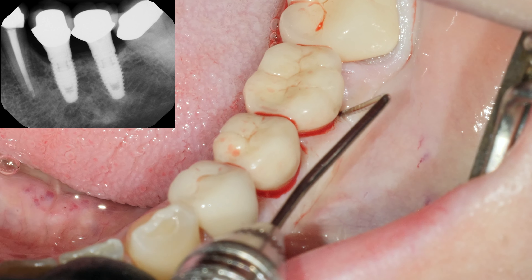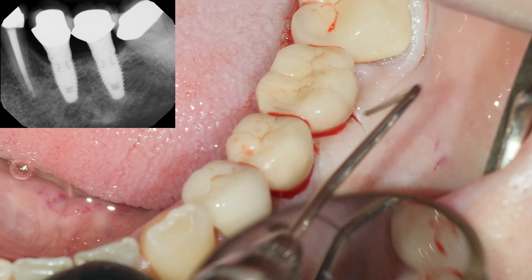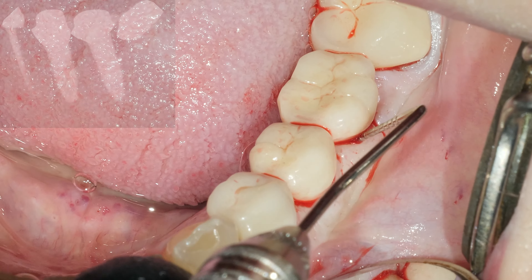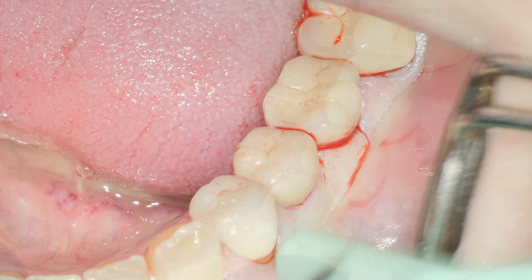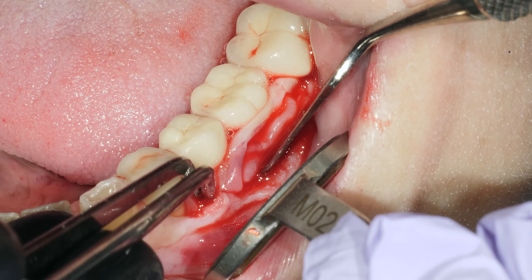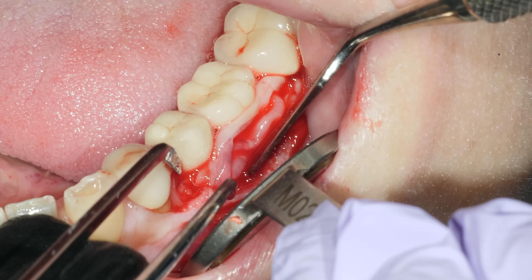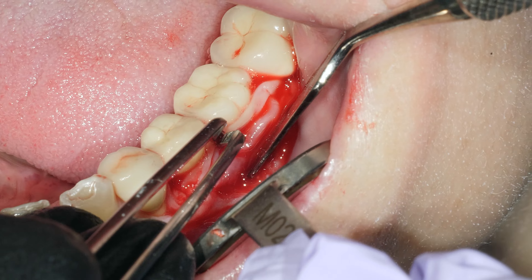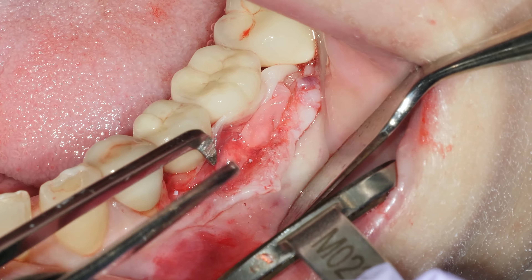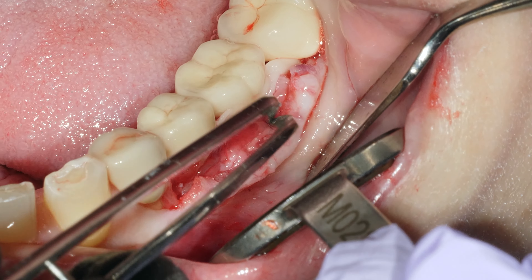This is an example of a decontamination and grafting case of peri-implantitis — a moderate peri-implantitis. We first probe to check our categorization. There are a ton of growth factors in it, and when you're dealing with peri-implantitis defects it's important to use the most osteogenic potential that you can.